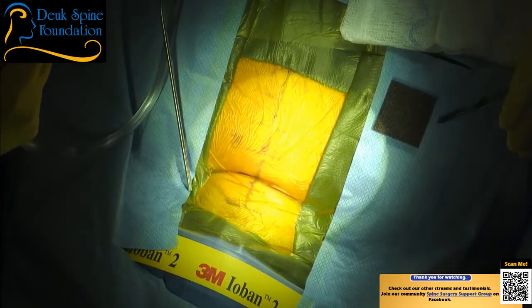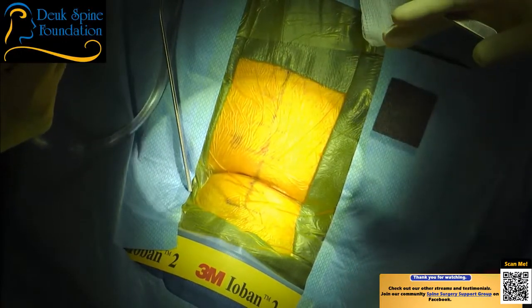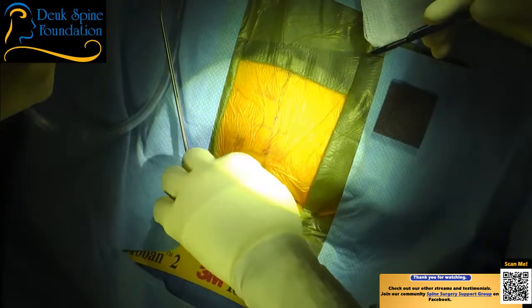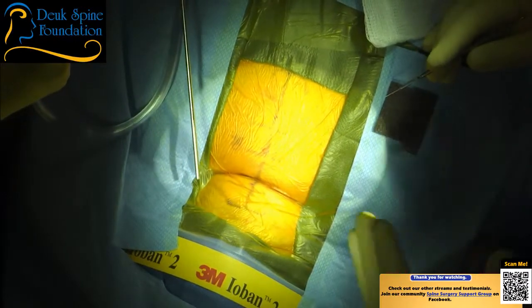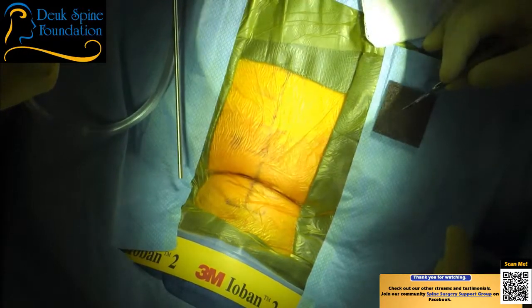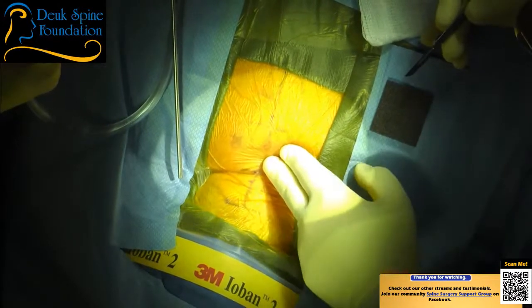The problem is if we do this surgery like we're about to, it's going to destabilize the spine, and over time her head will sag down onto her chest. So her chin will be resting on her chest, and she won't be able to pull her head up. So we want to prevent that development of that chin-on-chest deformity, so we're going to be doing an instrumented fusion with bone graft, and we'll go through everything as we do it. At the end, we'll put a drain in and some antibiotic powder.